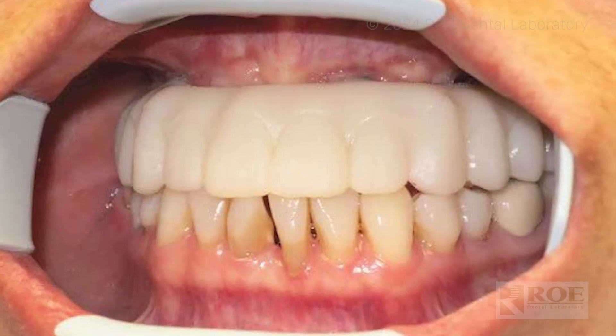We also need the opposing and the bite, and the scan of the prosthesis in the mouth, along with a full face, full smile photo of the patient wearing their prosthesis. Once those records are sent to the lab, we can design your 3D printed prototype.